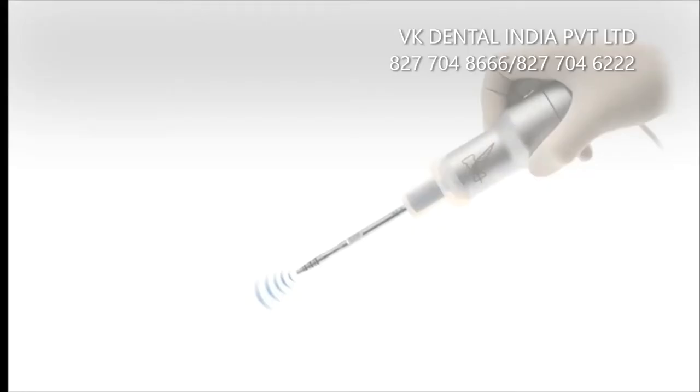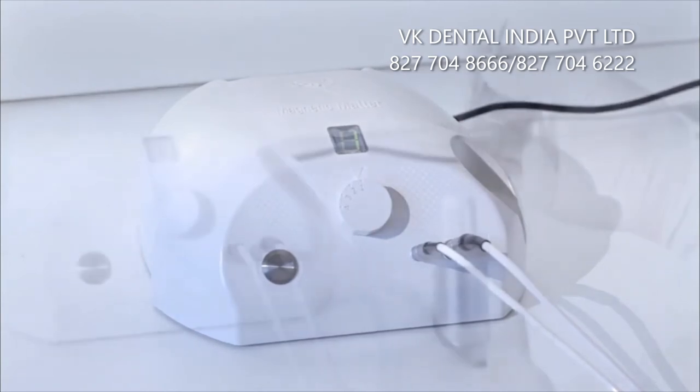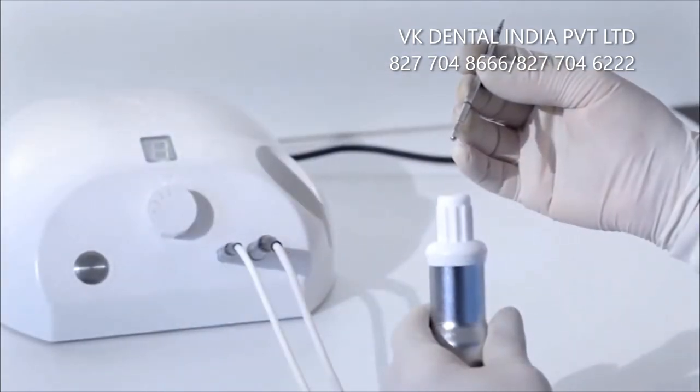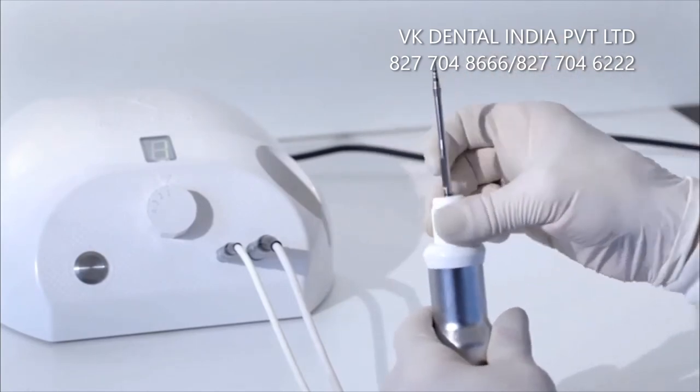Meta Ergonomica designed a magnetic, dynamical handpiece powered by a control unit, delivering pre-set forces by timing of applications. The osteotome is firmly hooked up in the instrument and the application time of the force is the best one to achieve the desired plastic deformation.